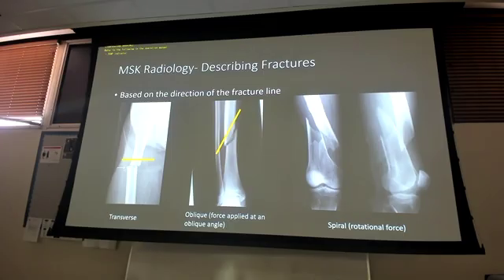The radiology department has a protocol of what they do, AP, lateral, whatever the case may be. But regardless, they're always going to present to you the images the way they are supposed to be presented, as if the patient is standing in front of you and looking at you. There will be special views you will learn in ortho, but those are for special cases.